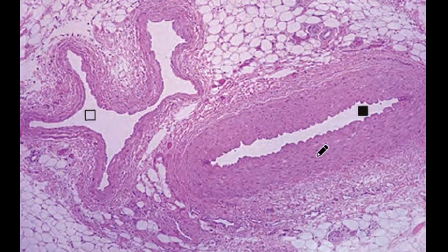This is again a picture showing the normal artery and normal vein. In the normal artery we have a thin-walled intima, a thick-walled media, and the adventitia. The vein has an irregular shape, and the media in the vein is very little compared to the artery. So this is the second picture.